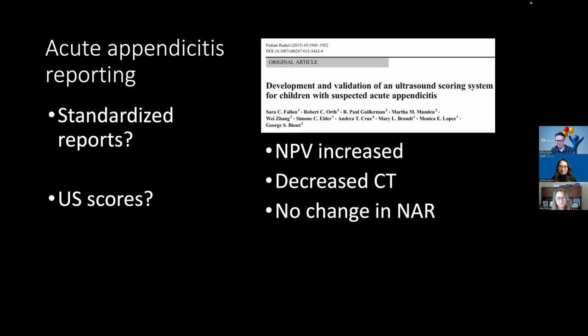Herculean effort. Yeah, I see both sides for sure, having been at the institution where this paper was published, and also here where we do not have it. I still use my same standardized reporting from TCH. It's funny, because back then it didn't matter what I said; the ER would just call me, like Jeffrey alluded to, and ask what the appendix score is. They need to incorporate it, and then they know the exact percentage. So I am a proponent for standardized reports, just for those exact reasons. It's like everyone's speaking the same language.